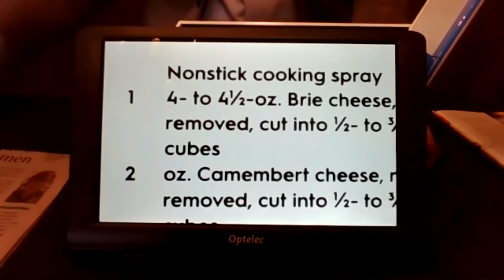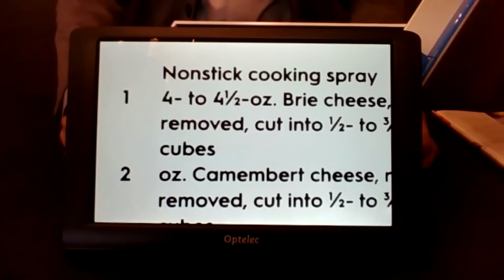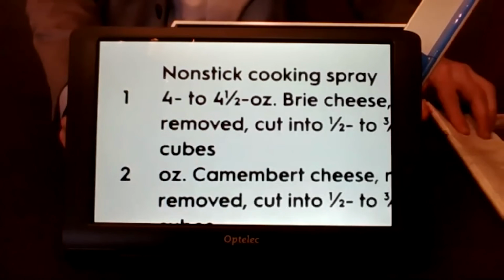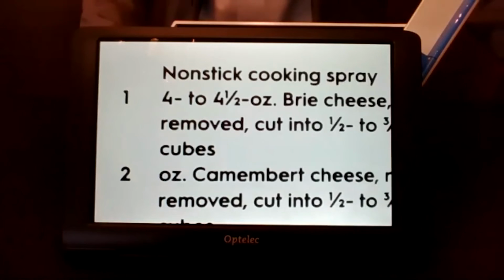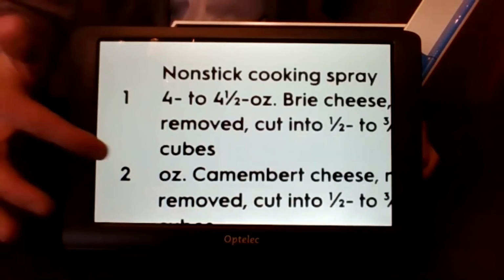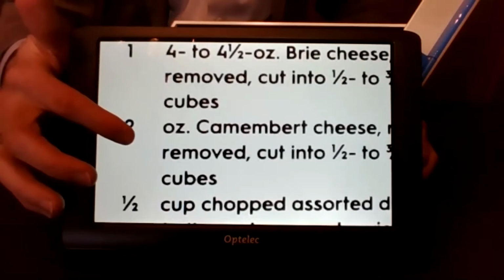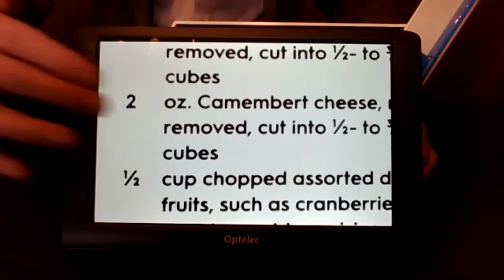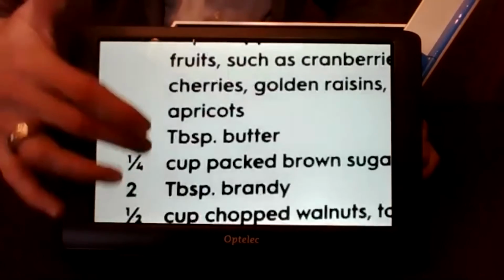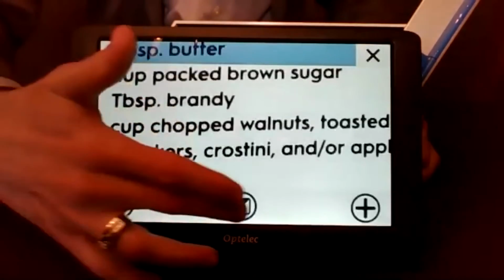Yep. Being able to put that under that extended camera, because of that much larger field of view, you capture the text, and now how you're navigating around that text, I think, certainly gives people an option to navigate text far more comfortably than some people would want to, rather than moving the document under the camera. And it's intuitive too, because with most of the technology today, it's super intuitive for most people to just touch the screen.